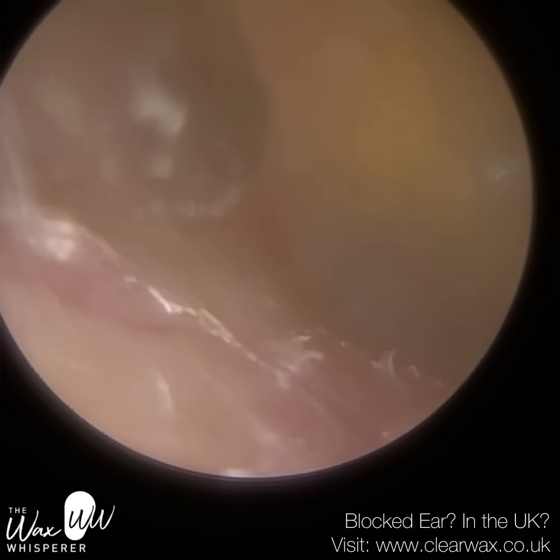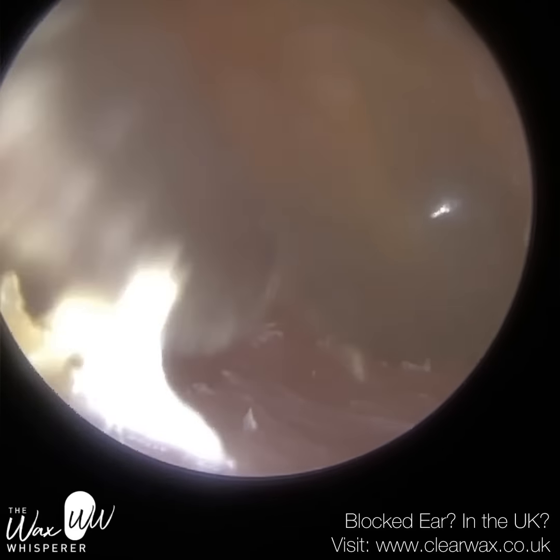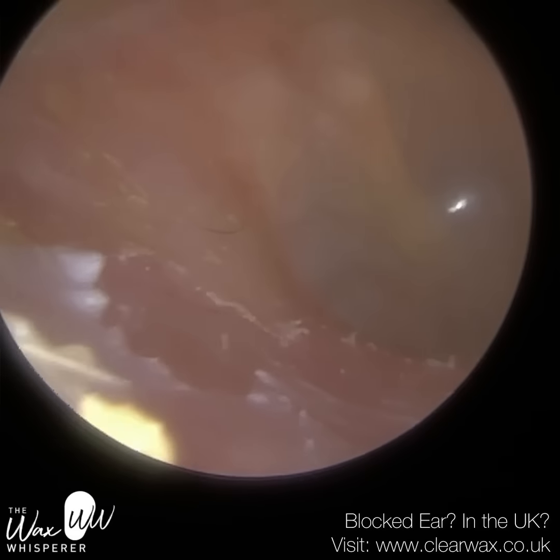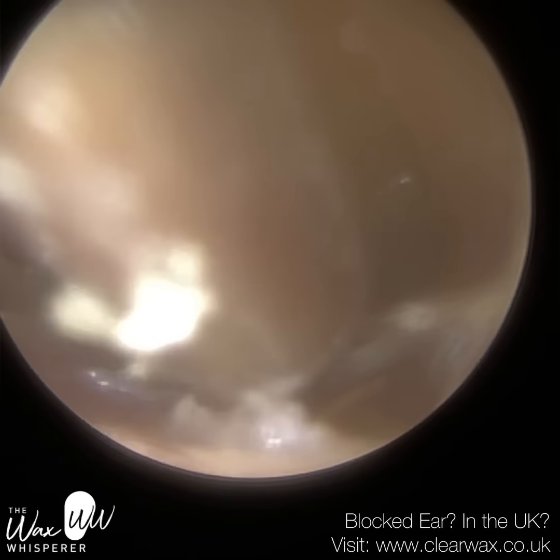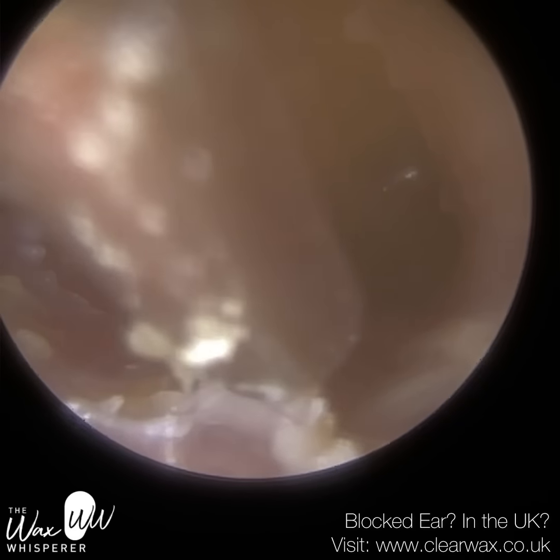I'm using the angle of the canal wall, and on top of that I'm trying to mimic the angle of the fine end, so when I'm peeling away, it's almost gliding against the back part of the ear canal, as opposed to poking against it. So that still we want to minimize the contact, because even gliding against the bony part of the ear canal, it can be quite uncomfortable.